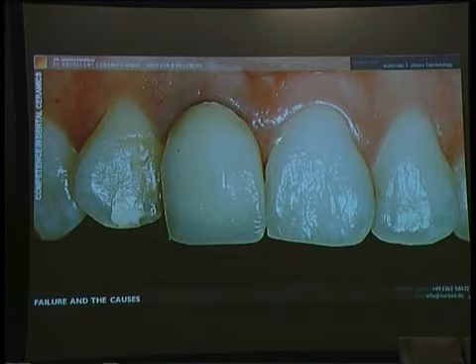At first, this crown does not respect the outer form of this. And also, it hasn't the characteristics of the natural teeth. And the surface structure, look, this is rough, this is smooth. And last but not least, it isn't the same color, it's too dark.